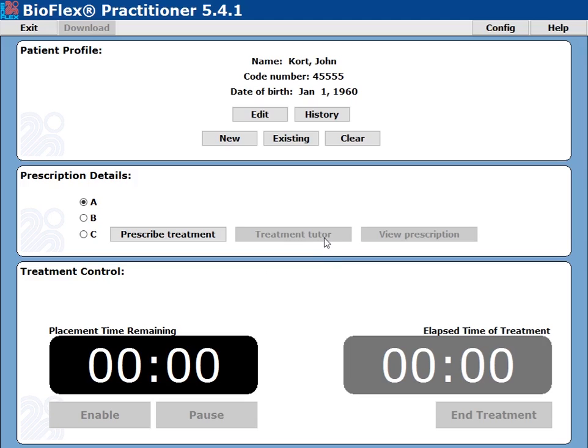However, let's say they have darker skin. Let's say this patient is African Canadian or African American, and they have quite a bit of melanin. If we chose the patient factors when we're inputting this patient, then every treatment time would increase by 20%. Which, for a longer treatment, might start to interrupt patient flow in a clinic setting.